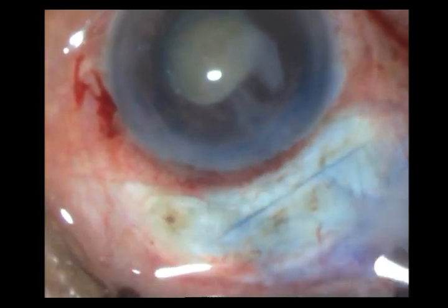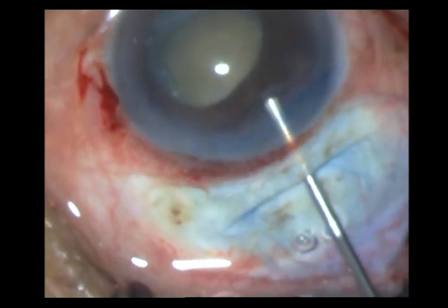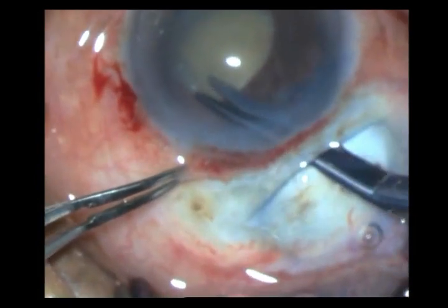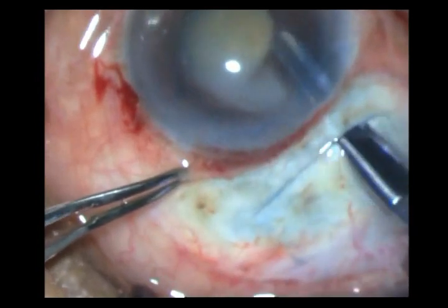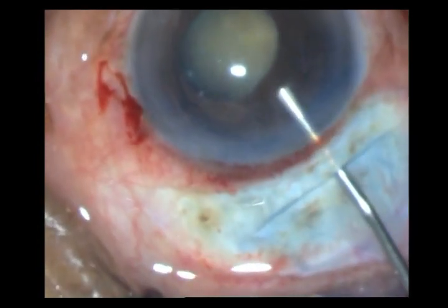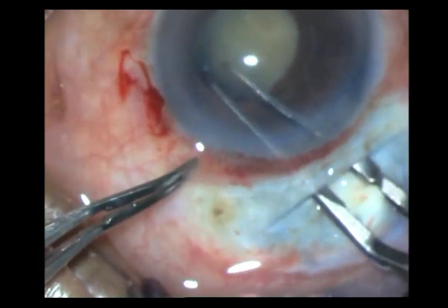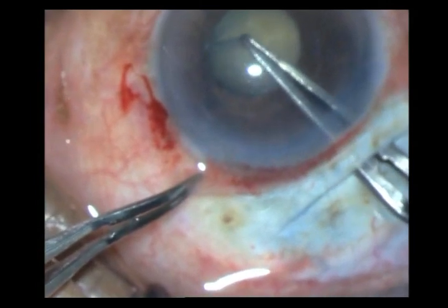The rhexis may not be adequate — that I will see later. Since I don't think it is big enough, I scallop one edge. I make a small cut with my Vannas scissors, then take my Utrata forceps and go ahead and scallop it. This should be adequate.